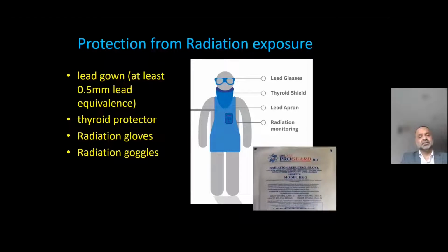Then protection from radiation exposure, I think this is absolutely vital. If you are going to be doing this for a living, for the rest of your professional life, you might as well pay attention to this, because you don't want to be exposing yourself to radiation. Although you could argue that patients don't have any protection, or mostly don't have any protection, but they are not being exposed to this day in and day out, which you would be.